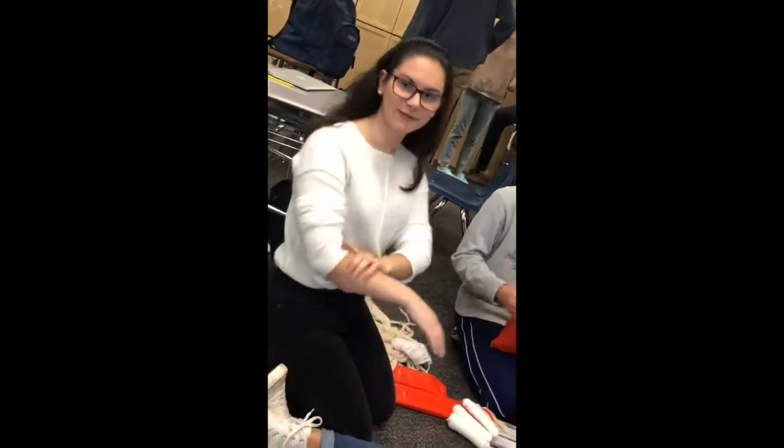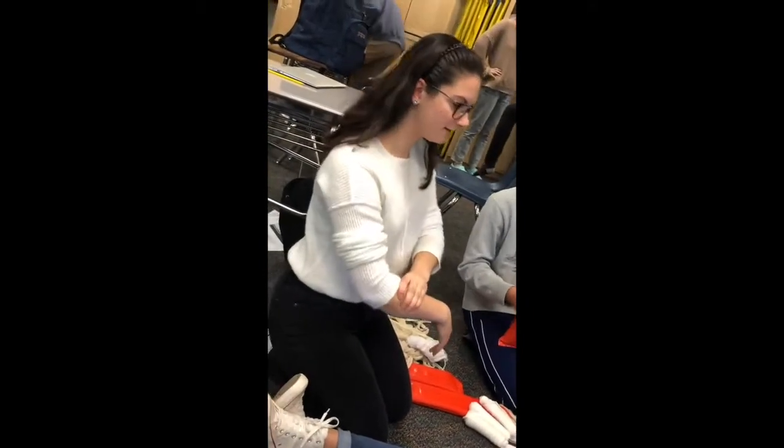All righty, so this one is for the radius ulna break. First, BSI scene safety.